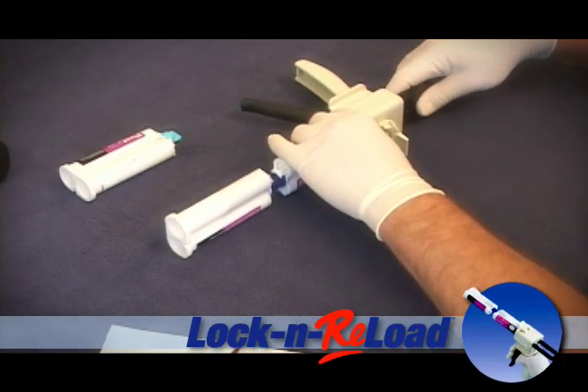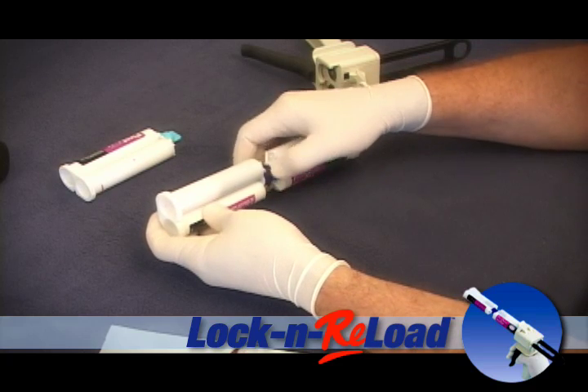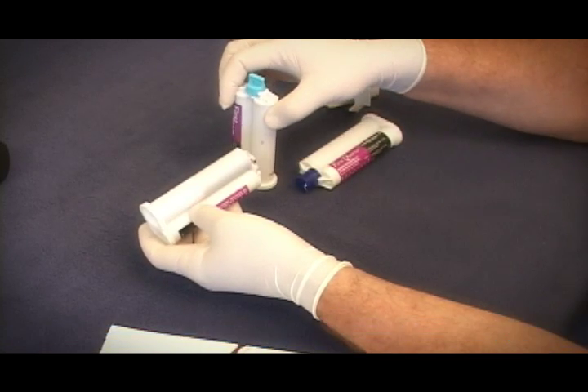Pull back on your plunger. Now disengage your cartridge by turning the coupler in the opposite direction until you hear a click. Grab your next cartridge and you're ready to start over again.